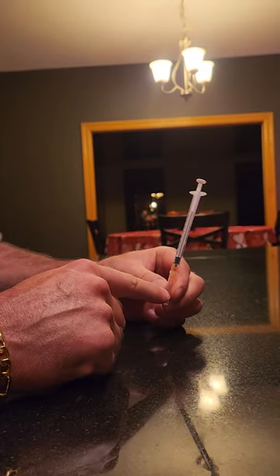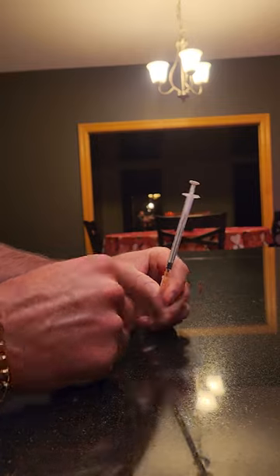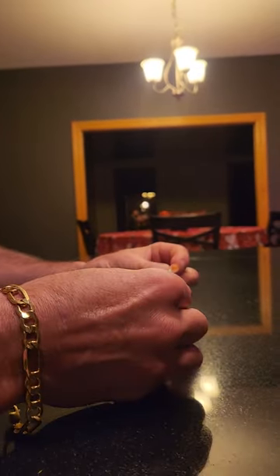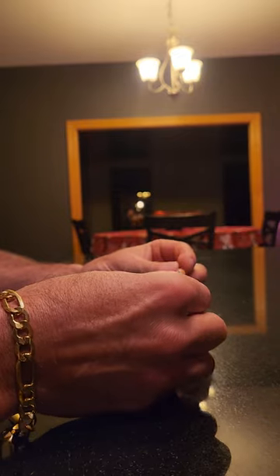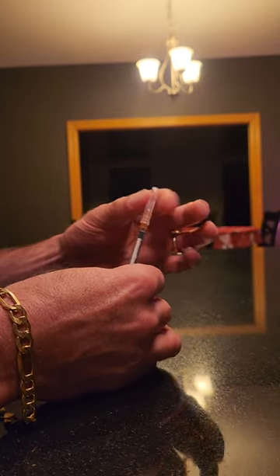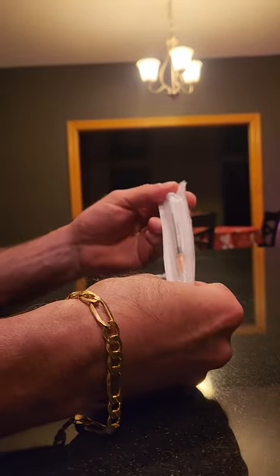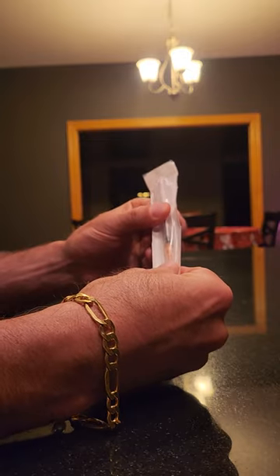We're going to demonstrate how you fasten the Luer slip syringe. A lot of you say that these slip off when you're using them. When they're packaged, they're kind of loose. So when you get a brand new one like this, a lot of times they're loose in the pack.